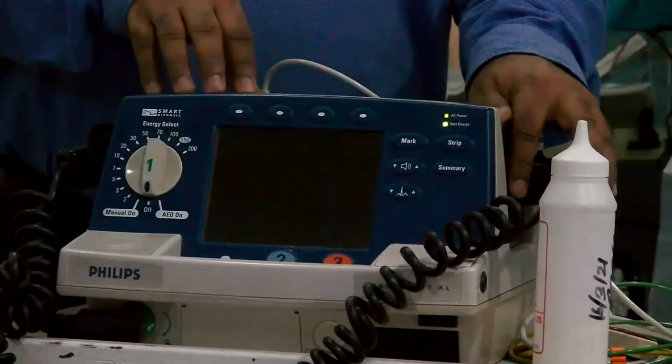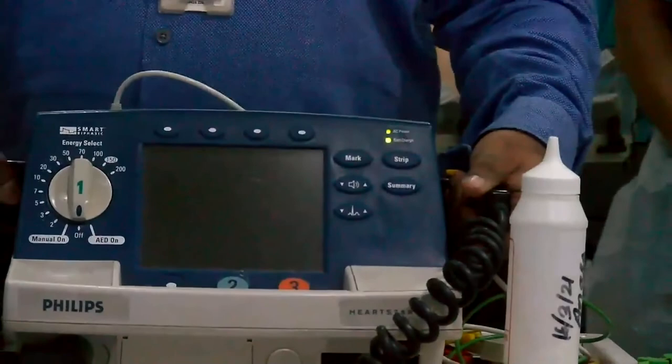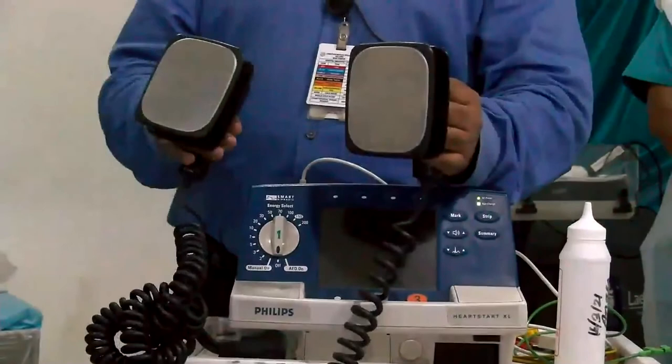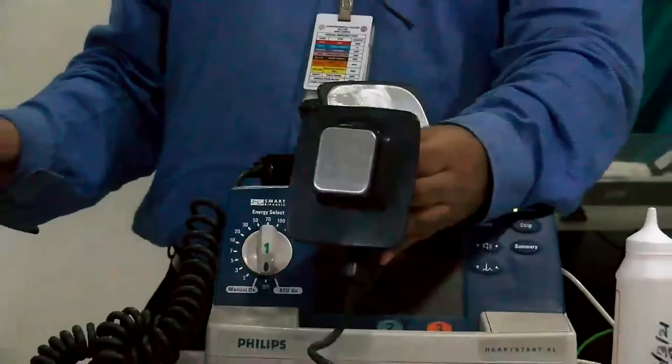We are not going into that detail; I'll just tell you the steps. So how to take your paddles. These are called paddles. These are adult paddles, which can be used for a child also. But for an infant, there is a button or lever here; you press it and take it. That is for less than 10 kgs or 1 year.